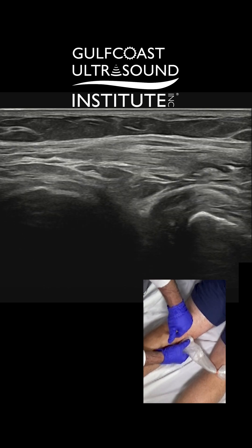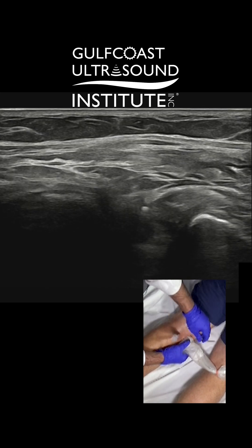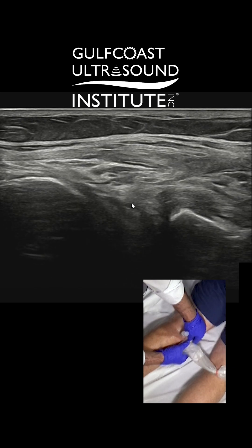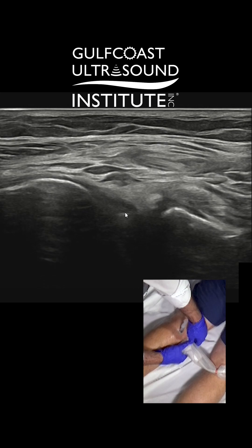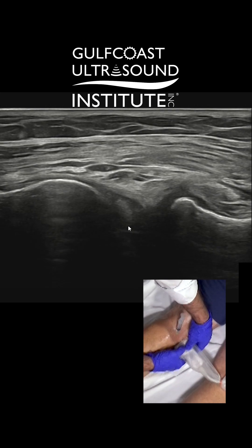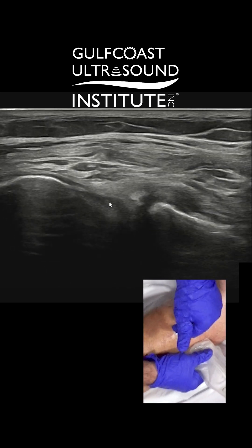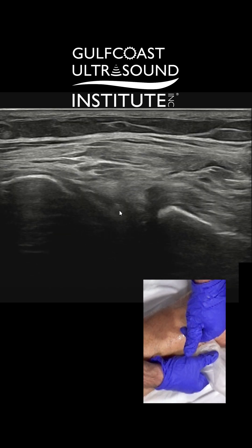I'm right in there now. So I'm going to put a little bit in there to numb it up. You see the needle tip? We're right in there. Now, I had to kind of move my probe along just to try and stay perpendicular. I started off here, but as I advanced I had to move the probe that way so I can stay perpendicular with the needle. And then wiggle it back and forth so you can see it right there.